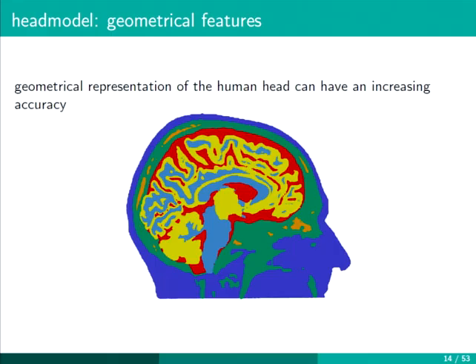So we have a very sophisticated pipeline, which of course isn't usable for the standard experiment, which requires a lot of data. So of course it's better to have some sort of optimization at this point, and especially the EEG is very dependent on conductivity values. But if you don't have a choice, you have to rely on the literature values. It's true that they also varied over time. I think it used to be a higher conductivity for the skull in early days. Yeah, that's true. There's still a lot of research to be done in this area.